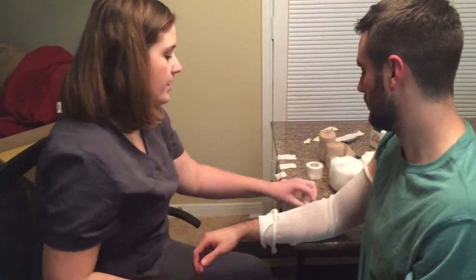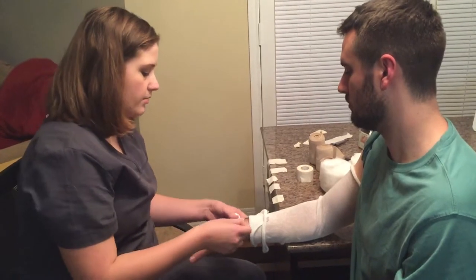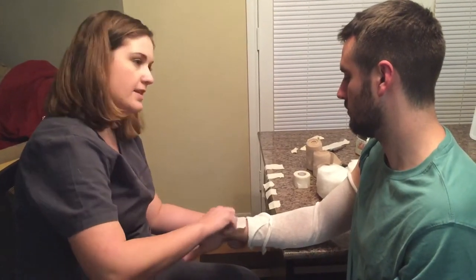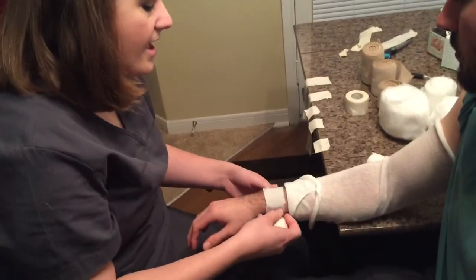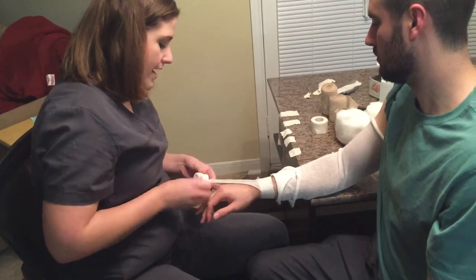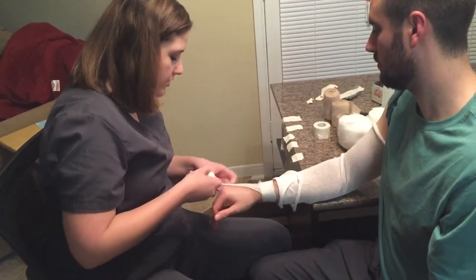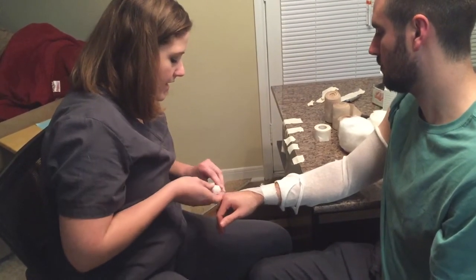The first thing we start with is this little bandage right here. Always start above this bone right here. You're going to start with this wrapping, anchor it, and it's going to wrap your fingers. If you wrap your fingers, it prevents your fingers from getting any of that lymph coming back into the fingers. When you wrap your fingers, start at the end of your finger and wrap half your nail bed and then go back down like this.